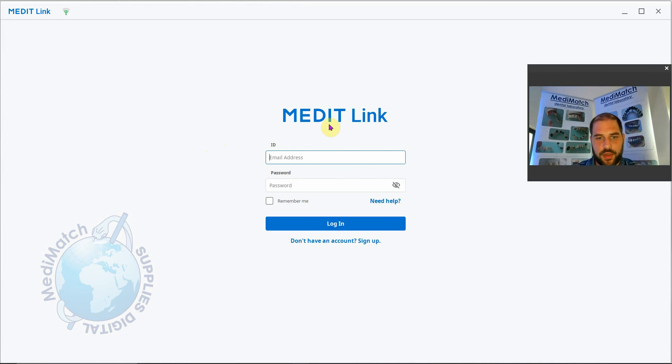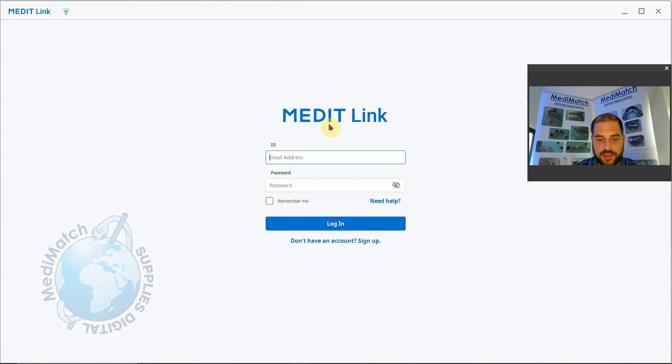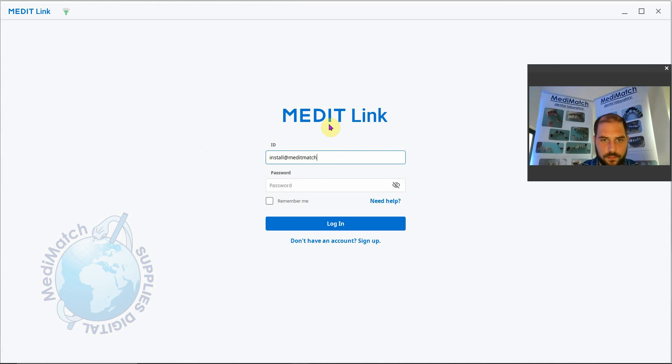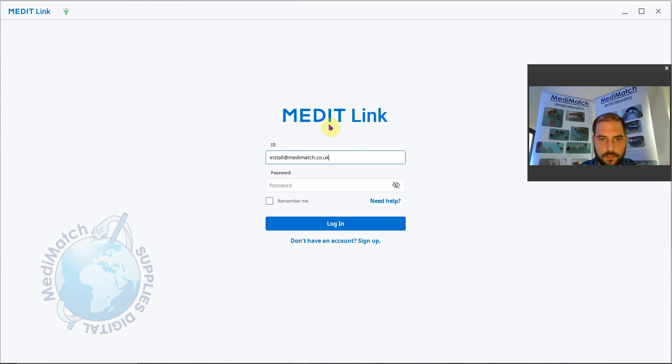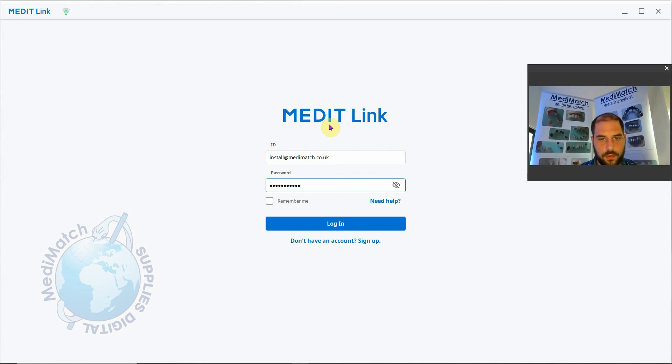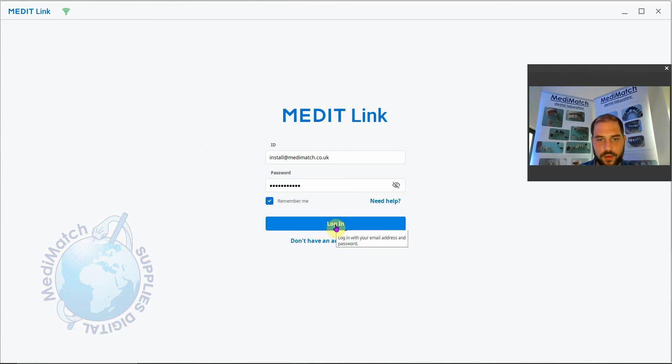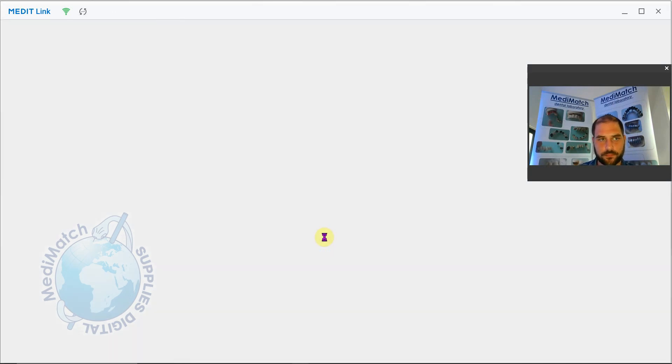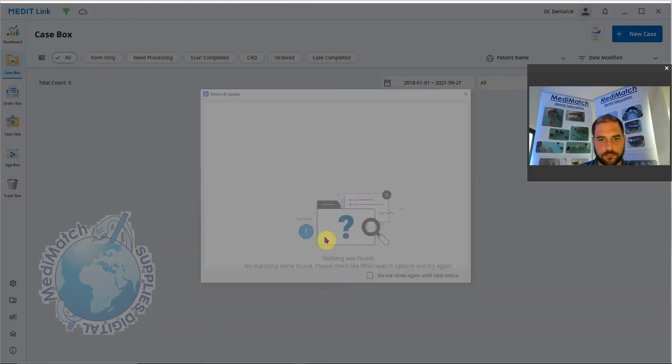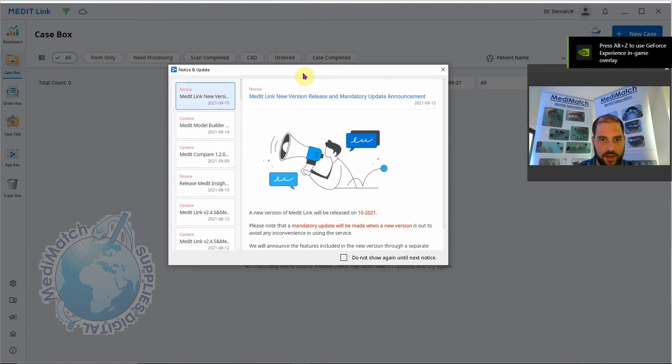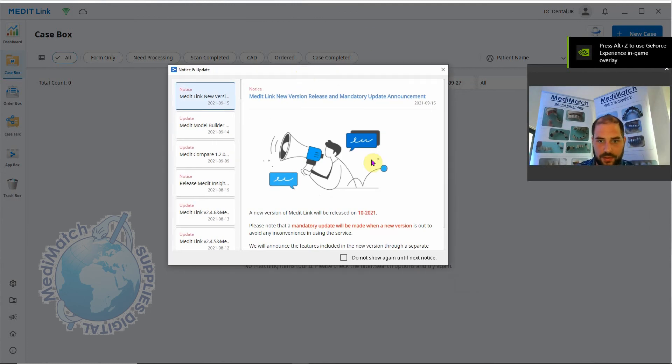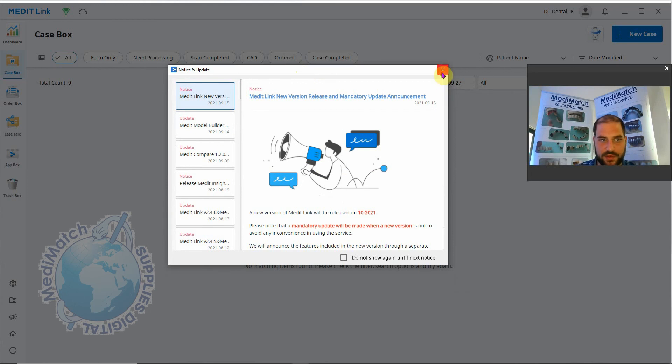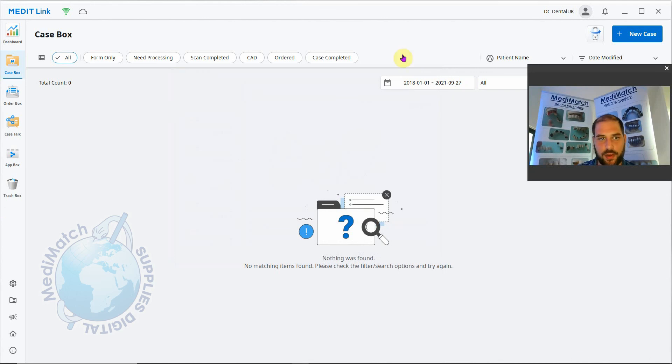The software's opened and we just need to put in our registration details. We can click the Remember Me button so you don't have to log in every time. Click login. Just like logging in on the browser, it'll flash up with any new update information or any notices. We can close this for now. And that's it. We've now got MediLink installed and ready to run.